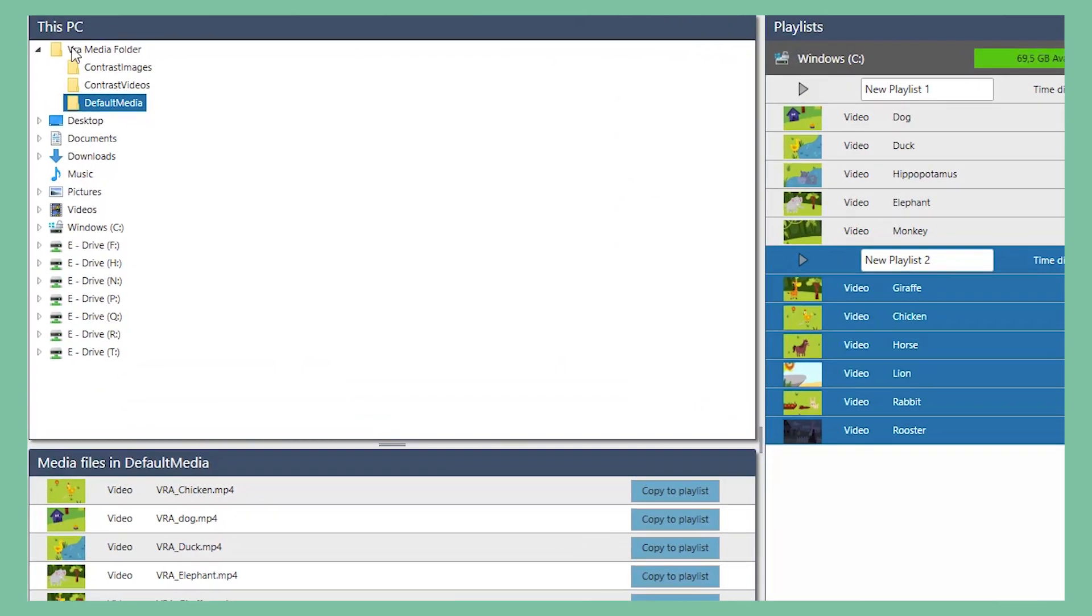You'll find the default playlist in the VRA Media folder on the left-hand side of the screen. Below that, the content of the PC will be available for you to choose from.